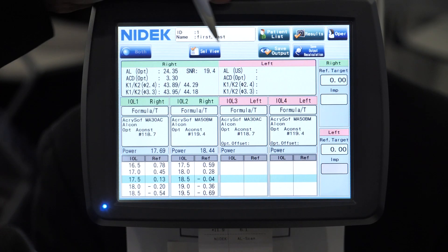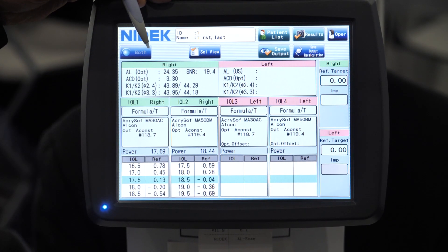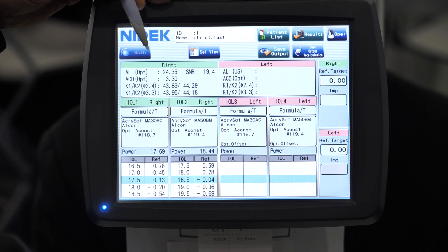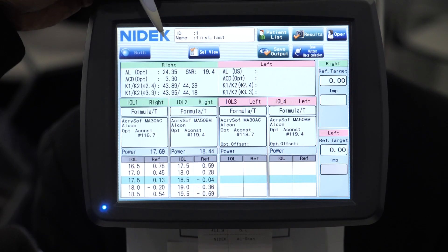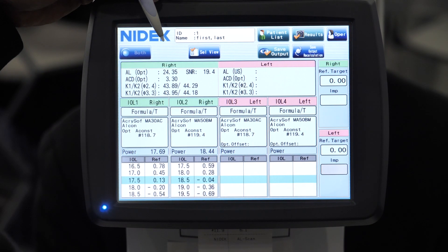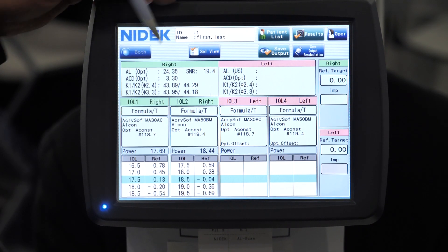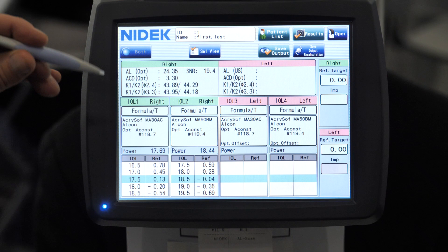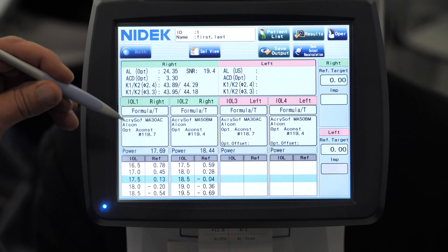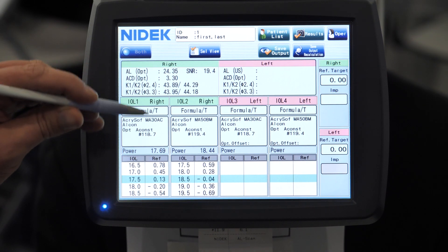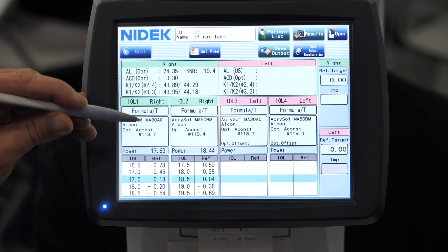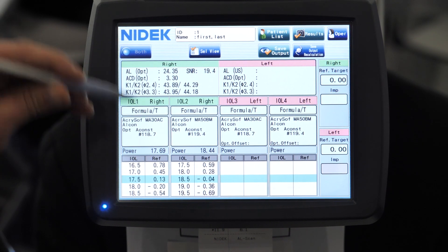As you can see here, it now populates the IOL calculation screen. We can customize this for each doctor in the practice, and we can have their most common IOLs already preset in here for them.